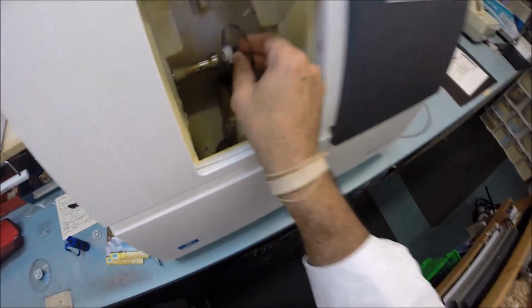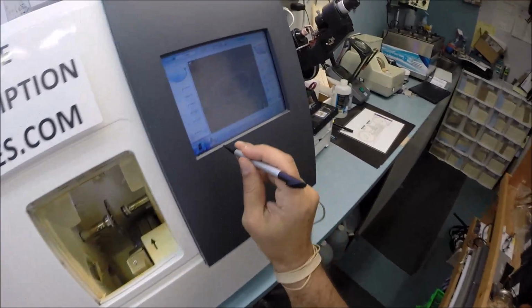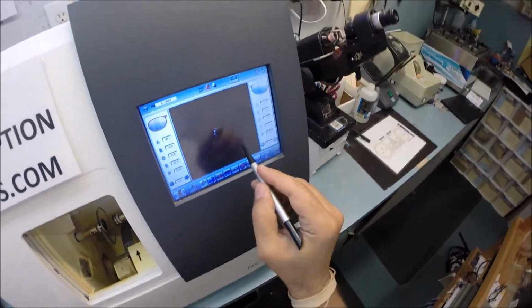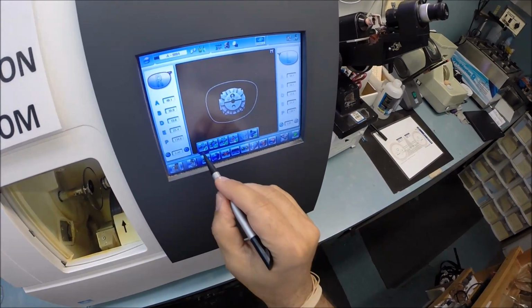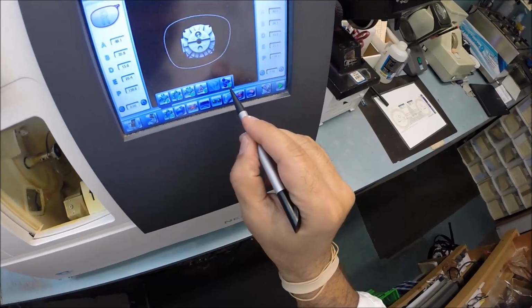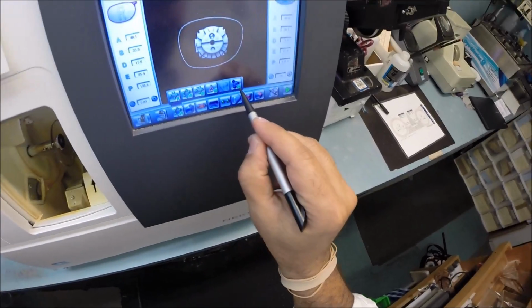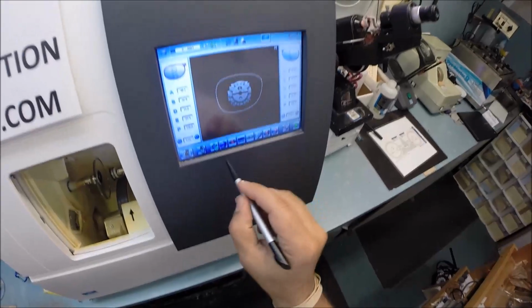Where are we at? Okay, so let's put the lens into the Chucky baby. And, okay, flashlight this. That's what I need. Hit that button. That is the shape of the lens we'll be cutting. These are polycarbonate lenses. If they were plastic, high index plastic, or Trivex, I would select that, or TBD, to be determined later. Some mystery material lenses will be made out of in the future, and then we can use that one. But for now, we'll stick with polycarbonate.